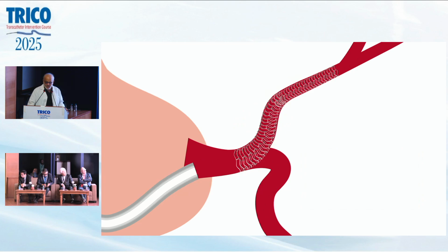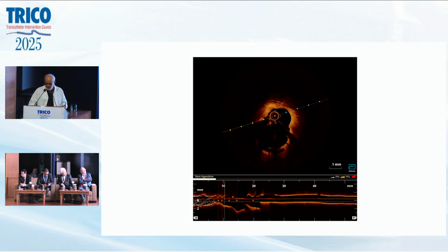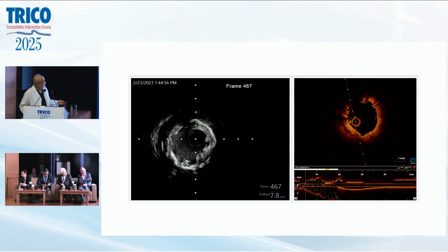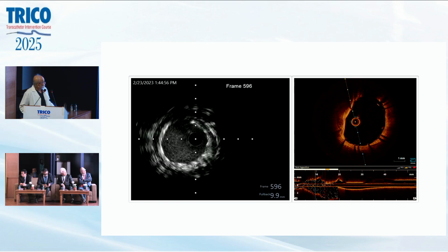So in this case, we interpreted it very carefully. The imaging was a savior. And I confirmed with both imagings. You can see this is in the sac, this is in the sac, and these are the true lumen images, side by side.